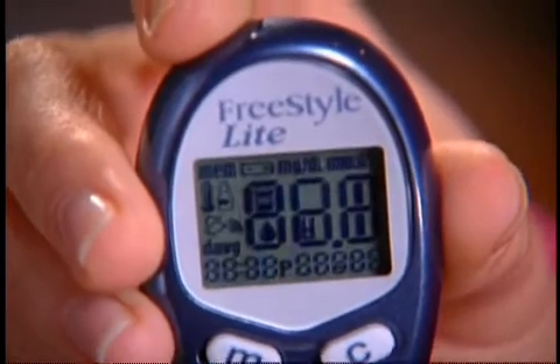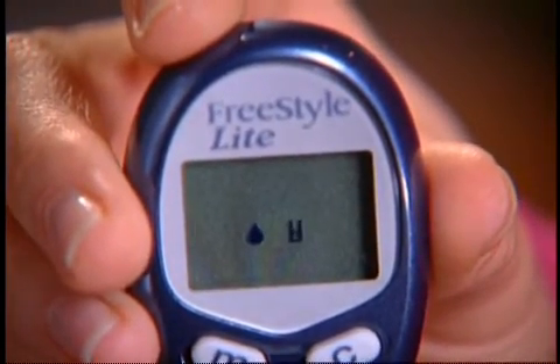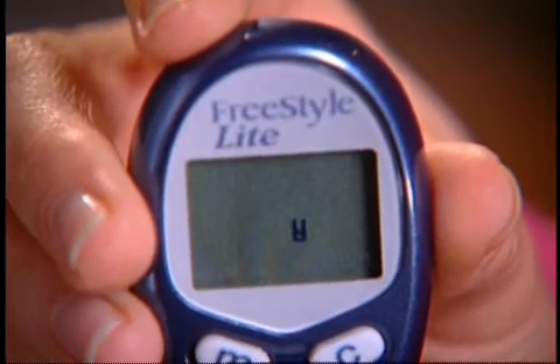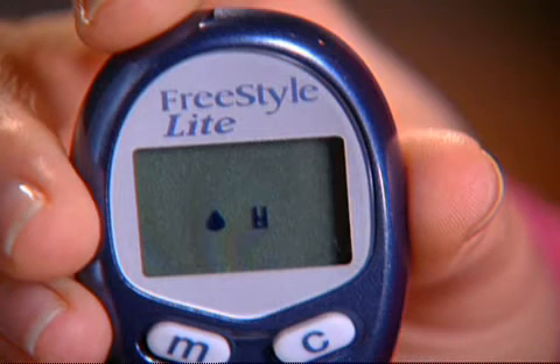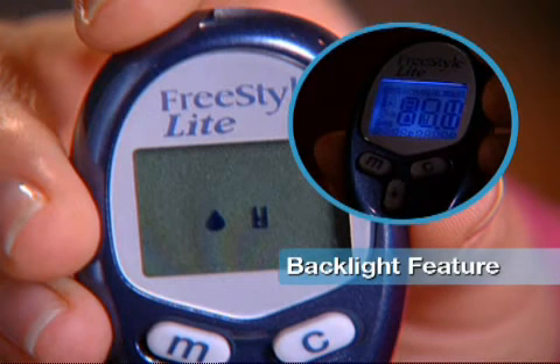Once the strip is inserted and the meter powers on, you should see both a blood drop and a test strip symbol on the meter display screen. This means that the meter is working properly and is ready for a blood sample. If you're in a location that doesn't have a lot of light, press the Light button to turn on the display backlight — this will make it easy for you to see the information displayed on the screen. And you're all set — it's easy, isn't it?